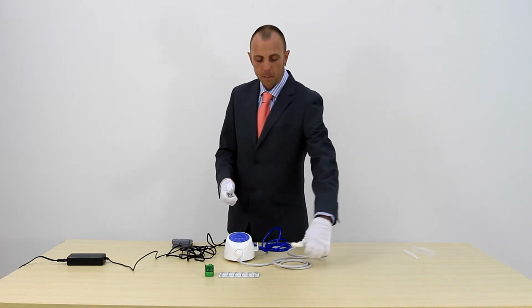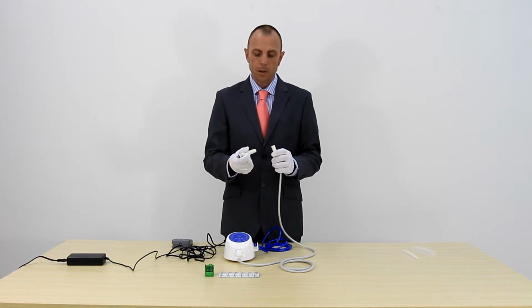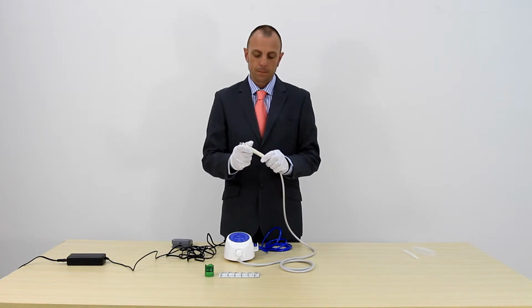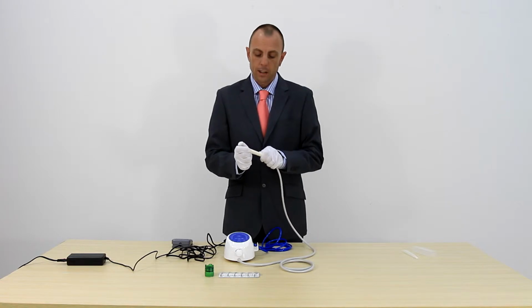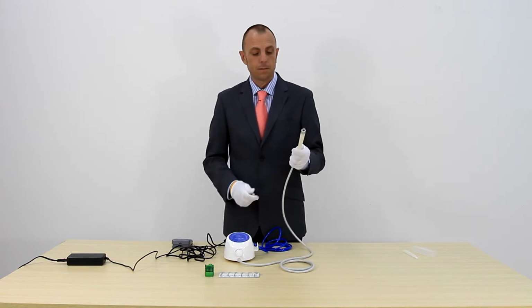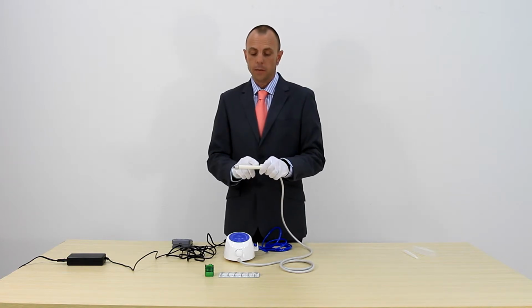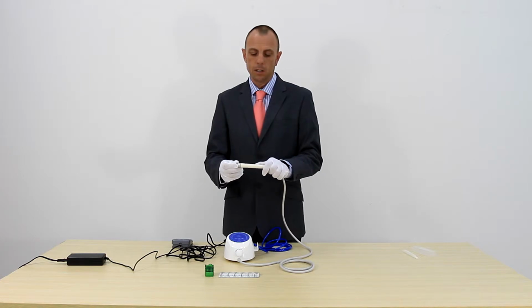And then we're going to pick up the handpiece cable directly from the machine, push on the handpiece to the cable. Push it all the way so you have a firm connection and you're not going to have any problems during use. When it's pushed all the way firmly, you should have no gap at all between the two connections. That's the handpiece connected.